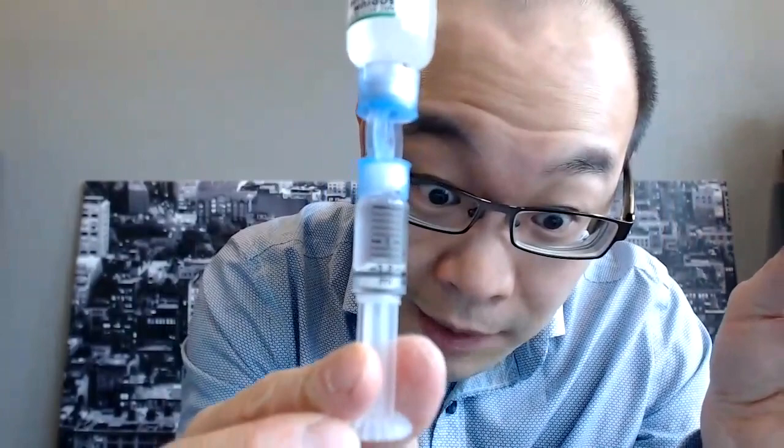Oopsies. So as you can see, there's some bubbles, and I'm just going to try to get rid of them. So you can see here, I filled it up to the 1.8 mil mark. And now all you have to do to disconnect it is you tug here, it comes off by itself. And this part is just a double-sided needle. See, needle on both sides. Which you shouldn't keep on the inside.